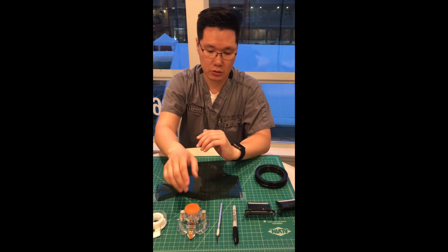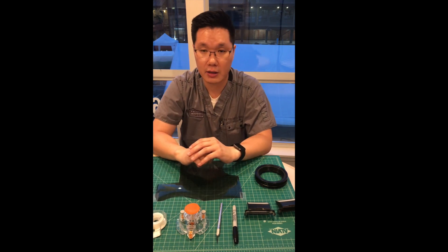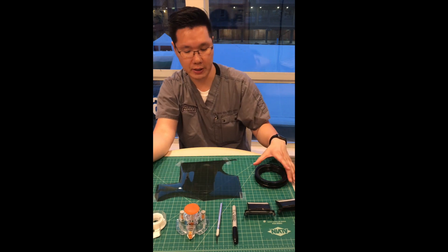So what I'm going to do is some measurements, mark, then cut, and I'm going to show you how you can actually paste that.